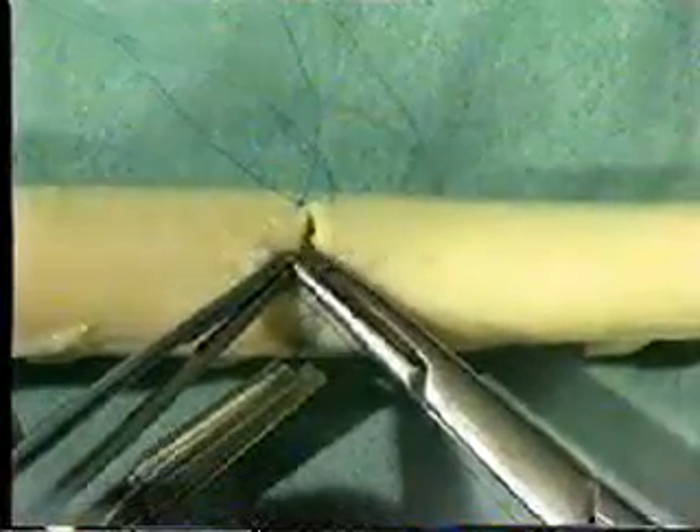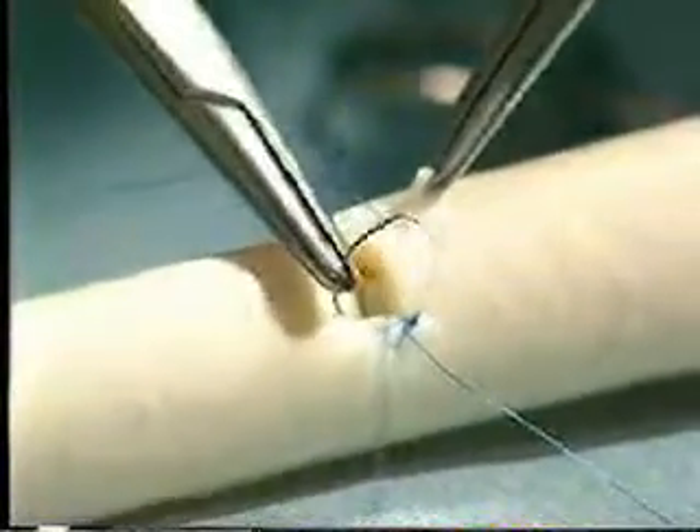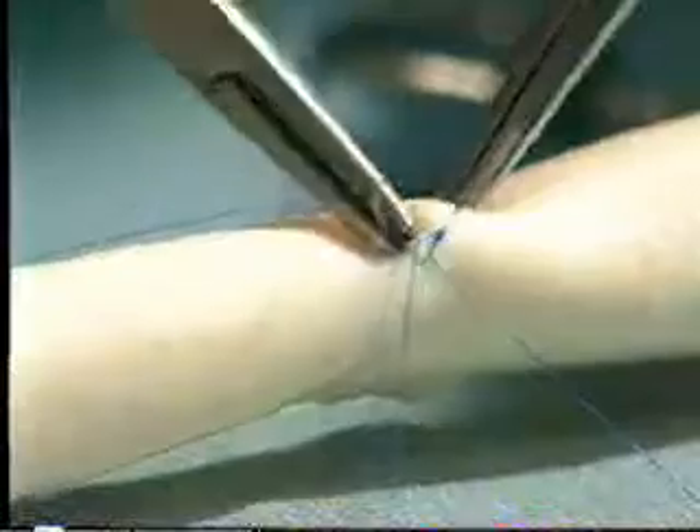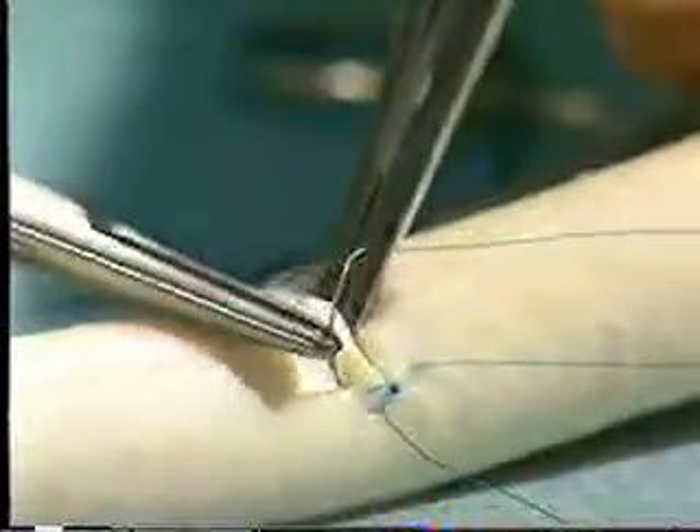Continue until you reach the apex of the vessel, then start again at the far corner. Once again go from outside to inside on the upstream part of the vessel, and inside to outside on the downstream part of the vessel. Continue in the same manner up towards the apex, being careful not to traumatize the vessel wall with your forceps and rolling the needle through the tissues rather than dragging it through.